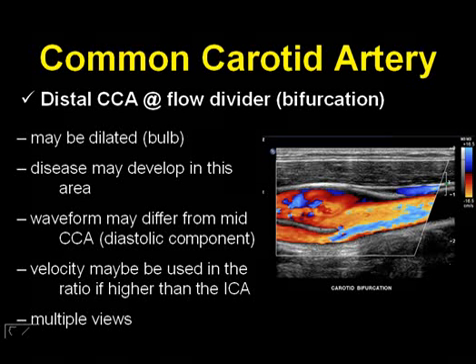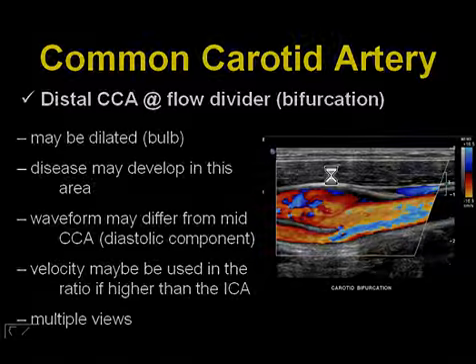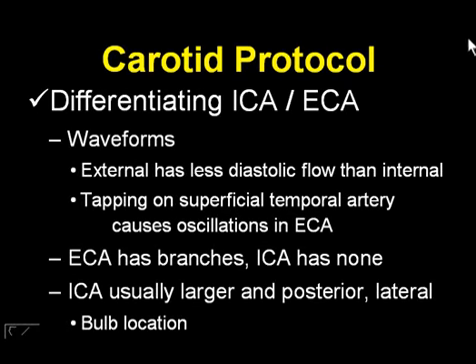It's also important if you see plaque and disease in this area to evaluate the vessel from multiple views when you're attempting to elicit the highest velocity within that lesion.